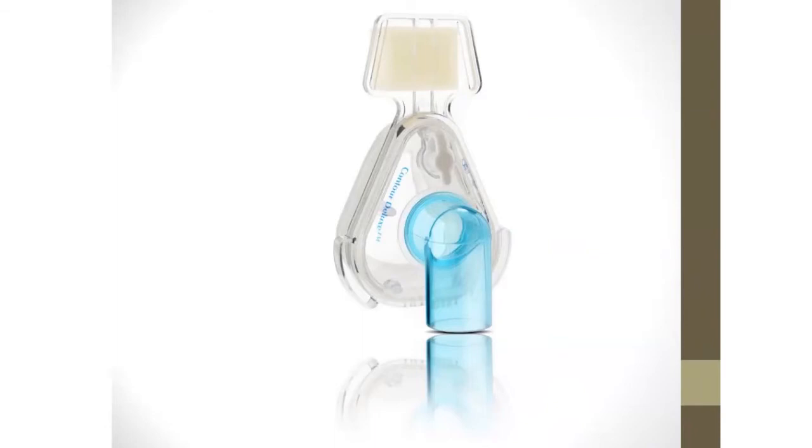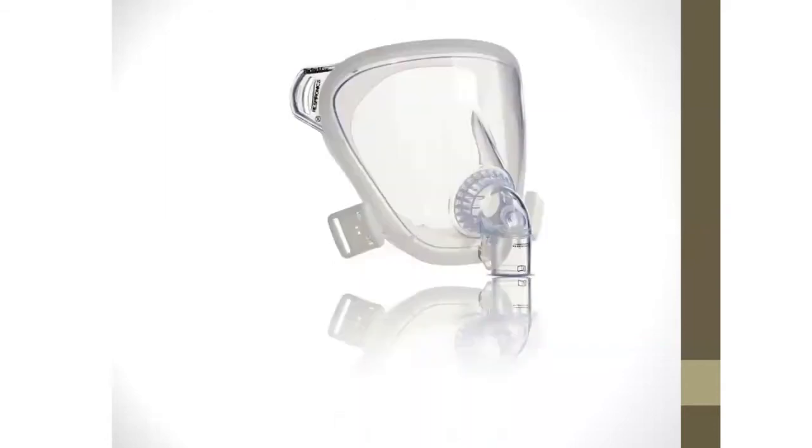The other disadvantage is that the nasal airway passage is narrow compared to the oral airway, so it acts as a resistance to applying the pressure. So it's a comfortable one, but it needs full cooperation and more support from our side, from respiratory therapists and doctors, to teach how the patient should use it.